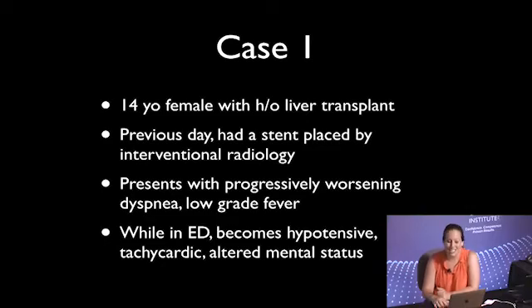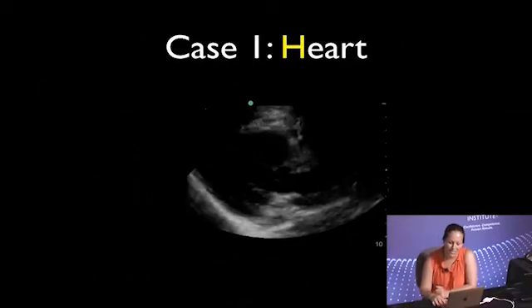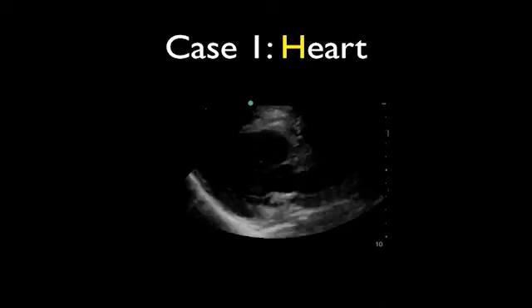She's looking bad. And then she starts to become a little bit wacky and not making sense, and her blood pressure goes low. So then I'm like, all right, get up out of my seat. Admittedly, this predated HIMAP, so I didn't do it in this order, but I'll present it in this order just so that it makes a lot more sense. So you can look at the heart first. Remember, this is a 14-year-old.